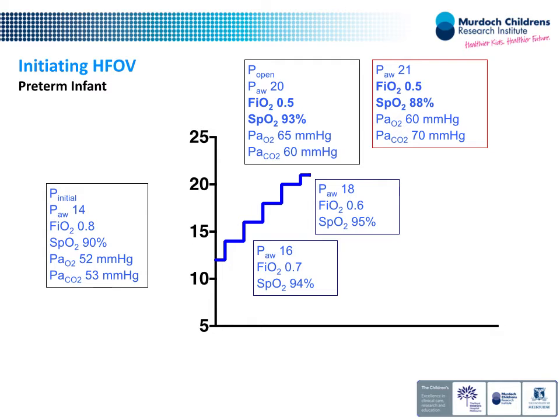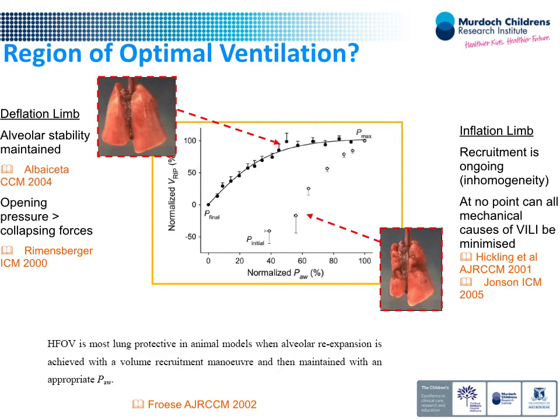And this is true patient-titrated ventilation, isn't it? Where the number is being dictated by the baby and information we get. So there is no value in going any more in mean airway pressure. We're just going to make the baby worse, and we'll start to get cardiovascular instability eventually as well. So the question is, what do we do now? We know that we have taken this lung probably from this state up to here somewhere. The best recruitment we can get, and now we're over-distending.